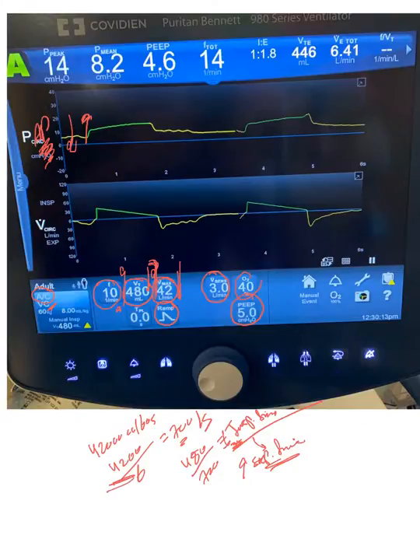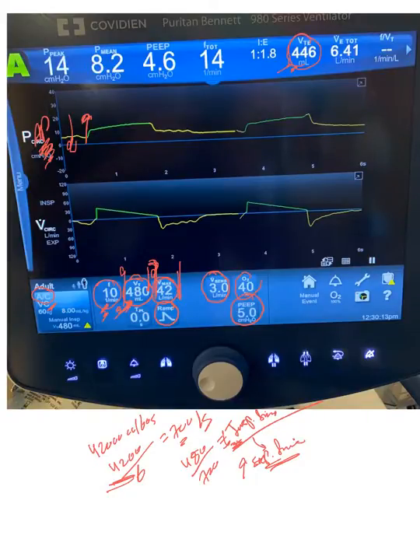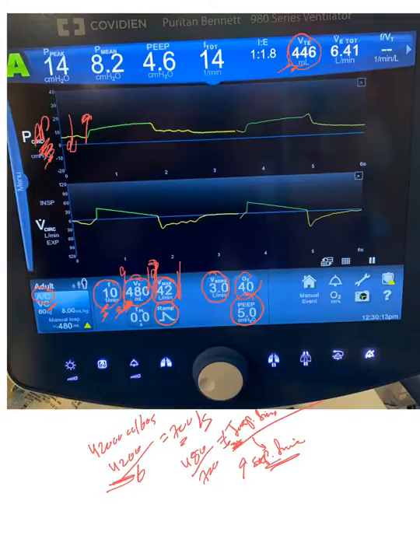The ventilator will guarantee the patient a minimum rate of 10 breaths per minute and a minimum tidal volume of 480 mL. Whatever the patient is pulling, the ventilator ensures delivery of 480 mL. Some patients with a very strong breath may pull more than this tidal volume, but the ventilator will always guarantee this backup rate and tidal volume.